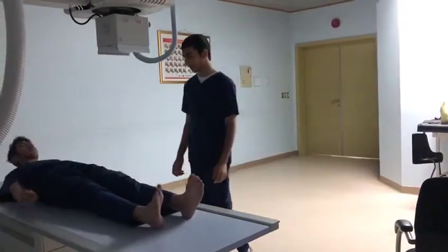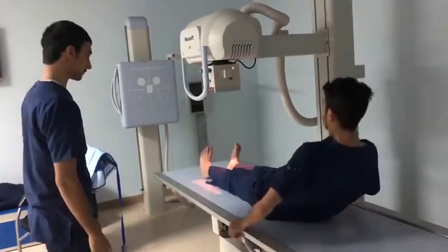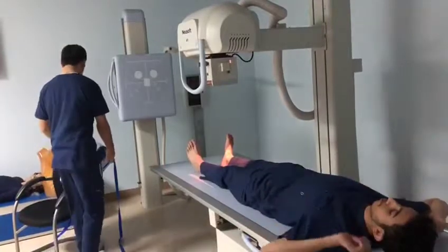Prepare the room atmosphere for imaging, then start to reposition the patient.